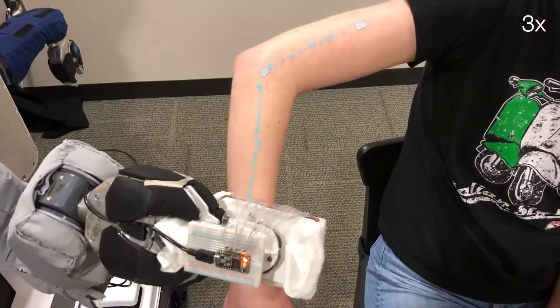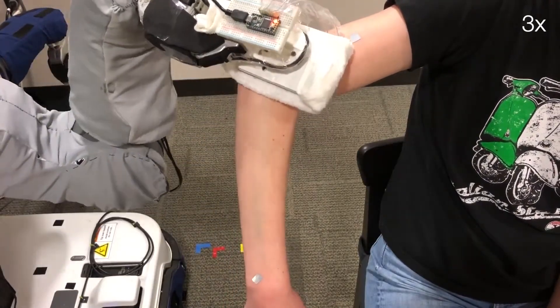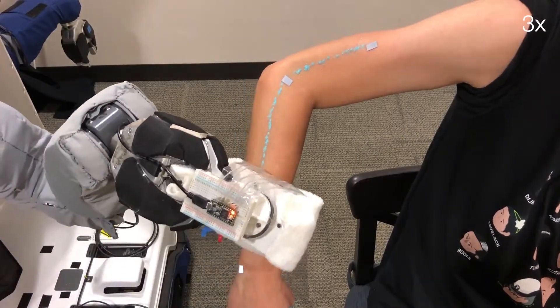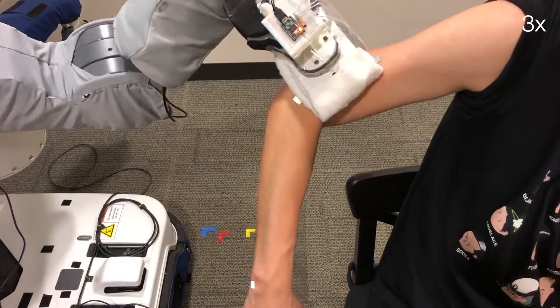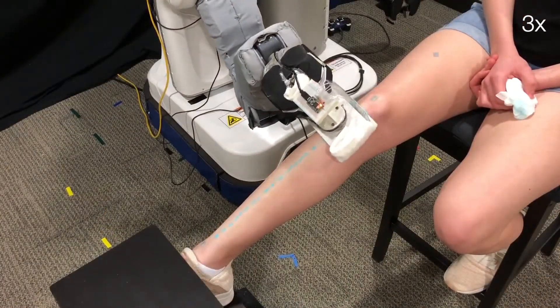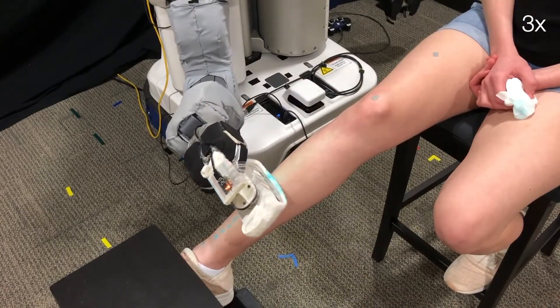Finally, we demonstrate how the robot can use this same capacitive sensing approach to assist with the task of bathing. Our robot holds a soft, wet washcloth and uses capacitive sensing to follow and wipe the outer surface of a person's body. We demonstrate how the robot can use this same approach to clean a blue powder off of the surface of a participant's leg.